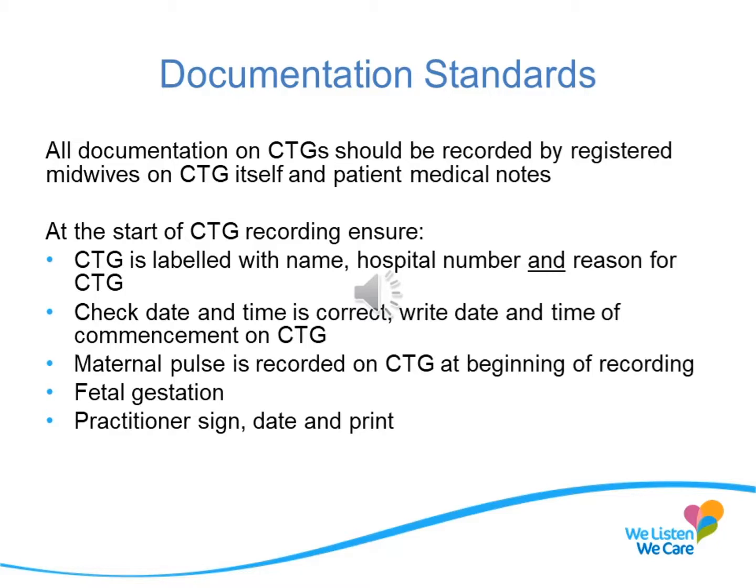With regard to the documentation of the CTG itself, all of the documentation should be recorded by the registered midwife, both on the CTG itself and in the patient's medical notes. At the start of the CTG recording, you must ensure that the CTG is labelled with the name, hospital number and the reason for the CTG. You must check the date and time is correct and write the date and time that the CTG was commenced. The maternal pulse must be recorded at the beginning, along with the gestation and the signature, date and printed name of the practitioner.